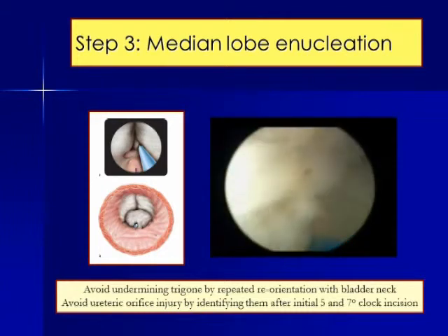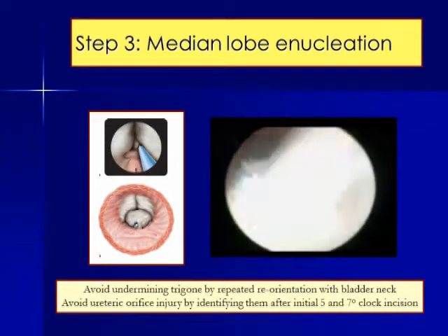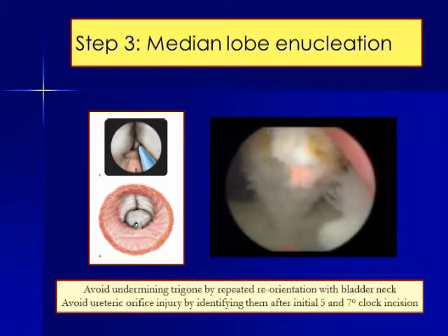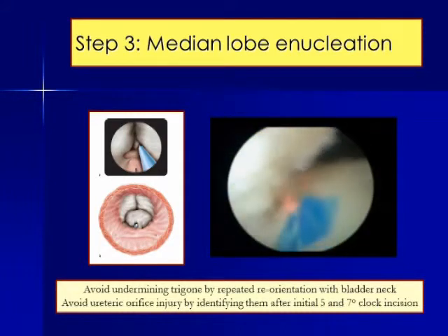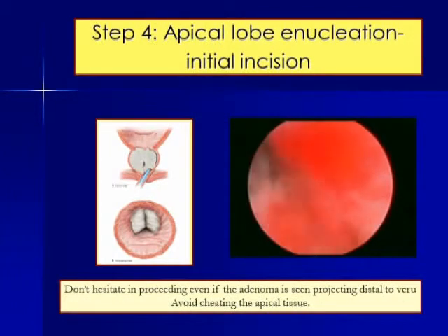This whitish tissue is all prostate that we can see, and once we cut that, we can see the circular fibers. This is how the median lobe finally is enucleated, and it is still attached only at the bladder neck level, and by further lasing it will be detached and it can float free in the bladder. Once this is done, important is the apical enucleation.